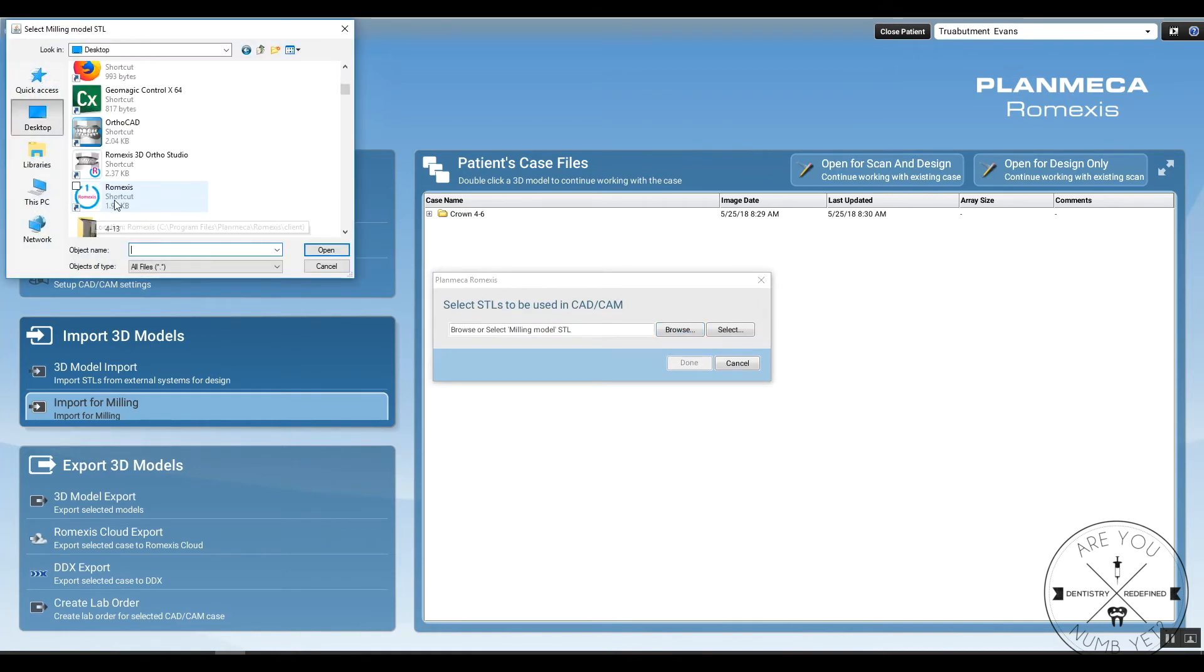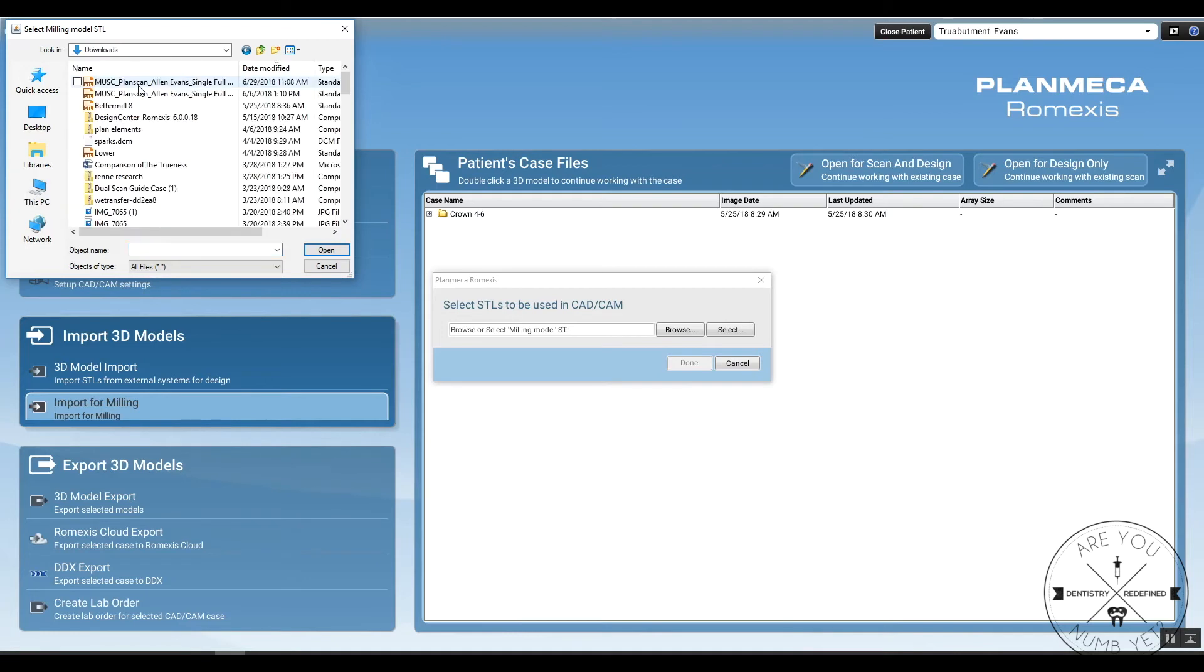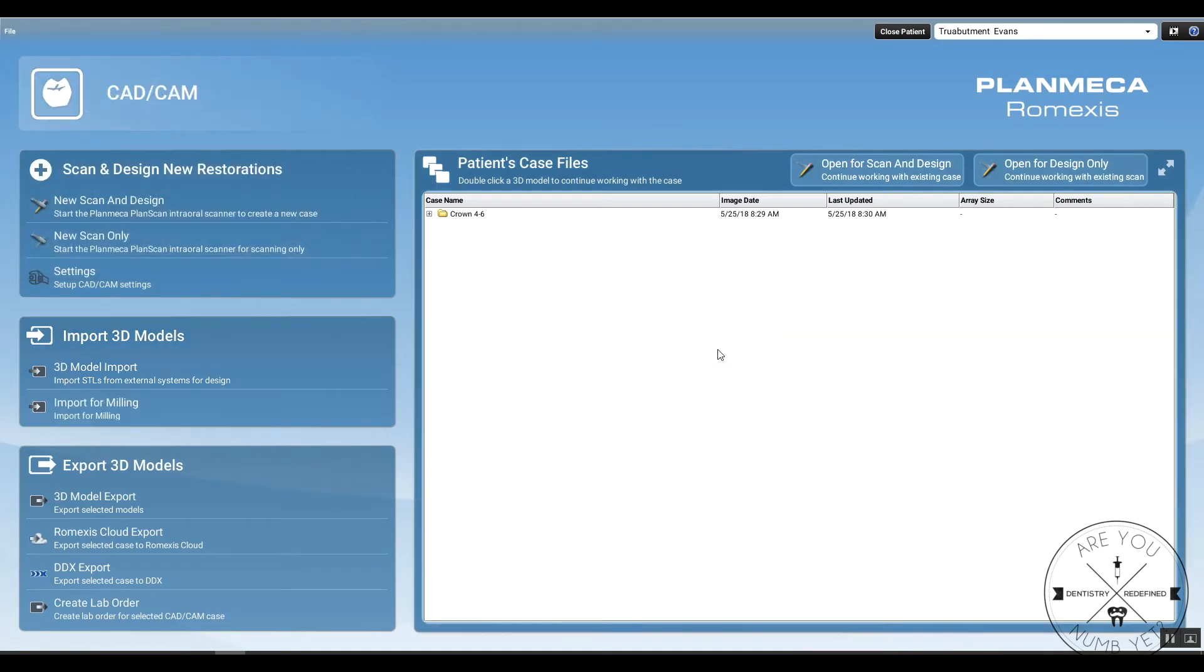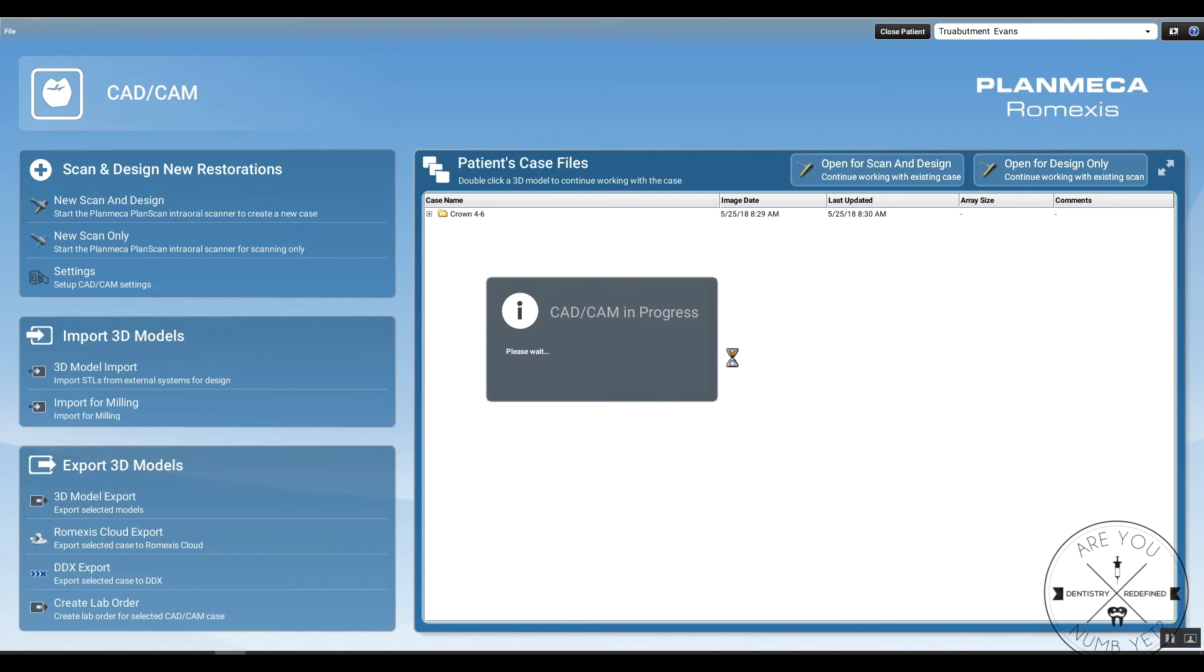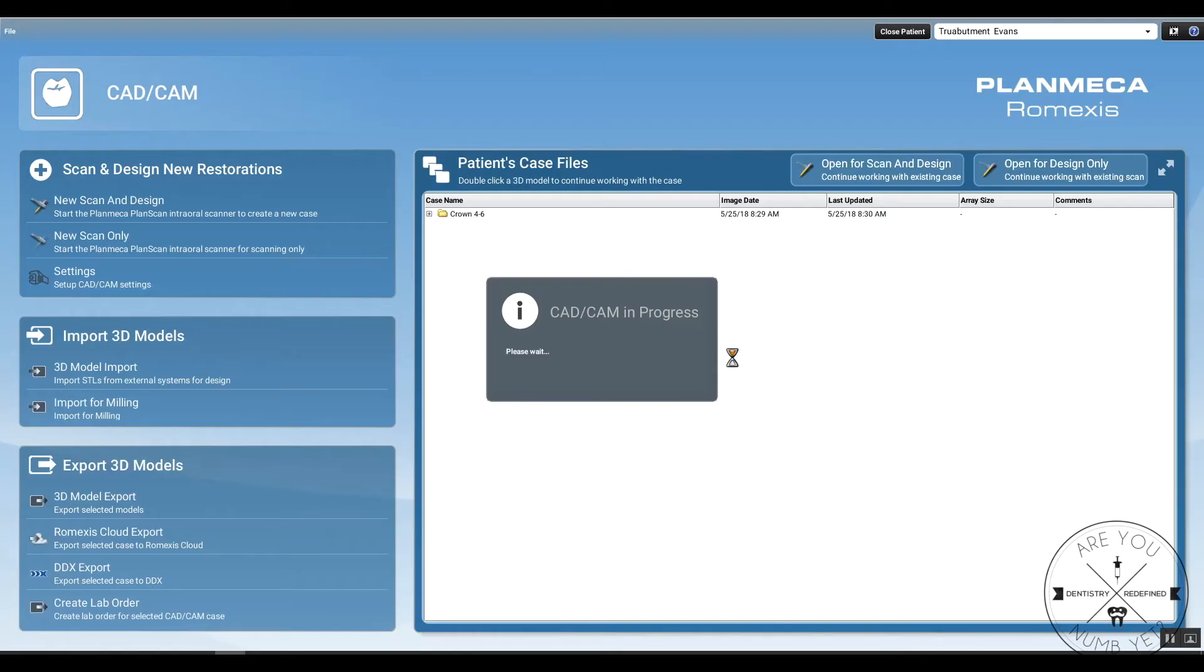Before you even get that abutment back, you're going to get this crown file. Then you open up the patient in PlanCAD Easy and you can do the import for milling. You're going to import the STL file of that crown, that True Abutment design, and you're going to mill it in-house yourself on Planmill 40, 40S, or 30S. It doesn't really matter which mill you have. It's going to work with this workflow.